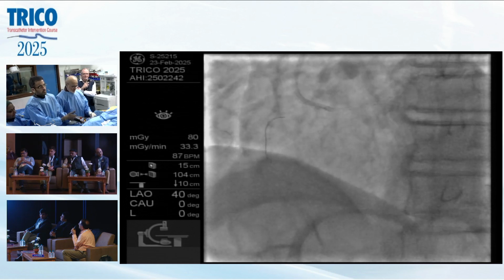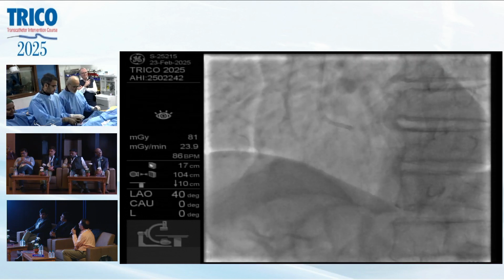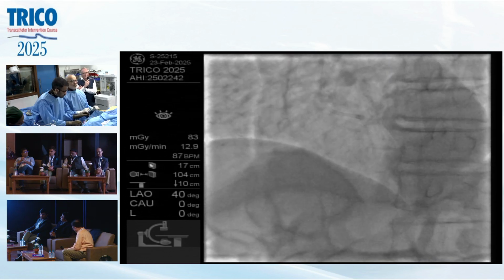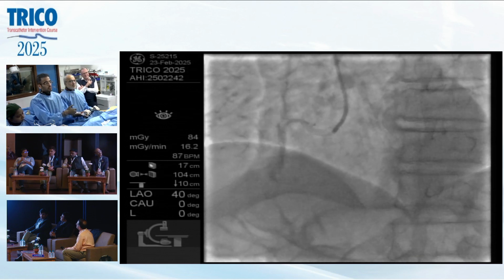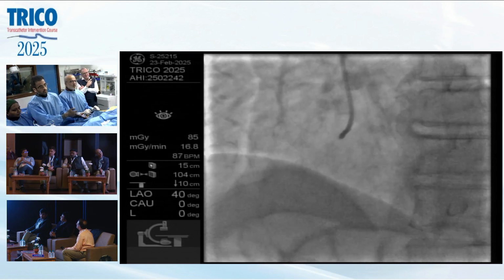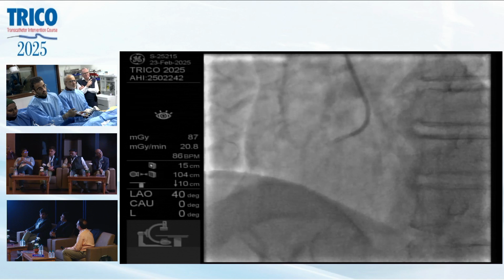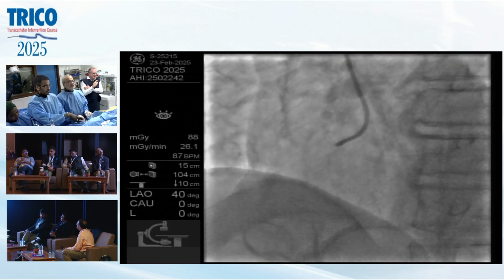No, it's coming out. Wait. Today is a difficulty day for me. Scout. Inject. If this does not work here, I will need a hockey stick catheter.